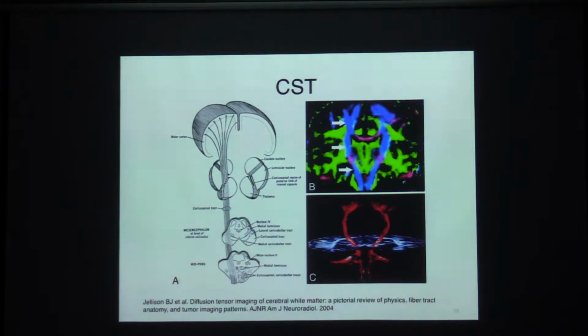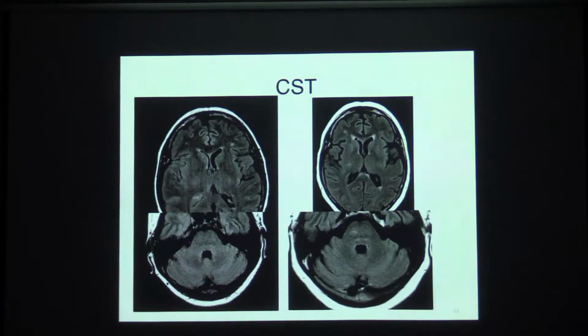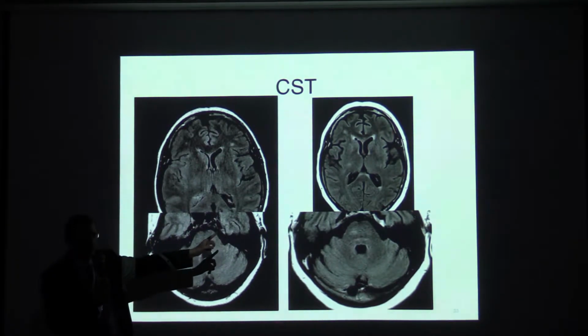So we'll review some of the white matter tracts, okay? If you remember this, fine. If you don't remember this, easily Googleable. But the point is that if you know that these things happen, then now you can find those tracts and try to look for tumors along that location. So the corticospinal tract, we already looked at, goes from top to bottom through the brainstem, right? For example, this was an interesting case where it was a high-grade glioma, and there's a lesion in the precentral gyrus, a lot of surrounding T2 hyperintensity, which is a mixture of tumor and edema. And when you look lower, these are the initial images, okay? And you don't really see anything worrisome. But on imaging from maybe 4 to 5 months later, you see that little T2 hyperintensity, right, in the posterior limb of the internal capsule.